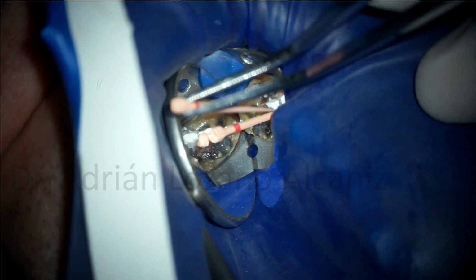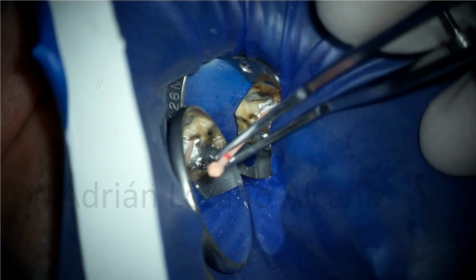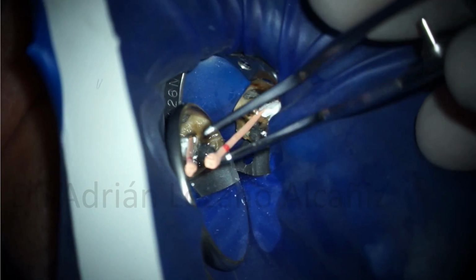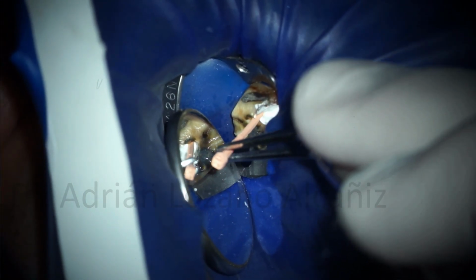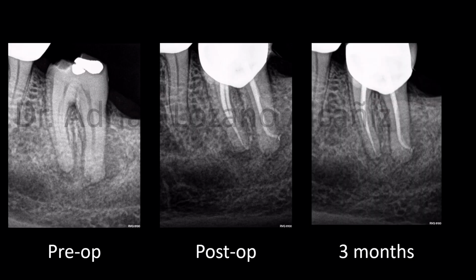Always the same. We go with the cones. Then with the distal canal. This is the post-op. This was very difficult to clean and shape. And this is the 3 months. Now here we can see that the lesions are going well.